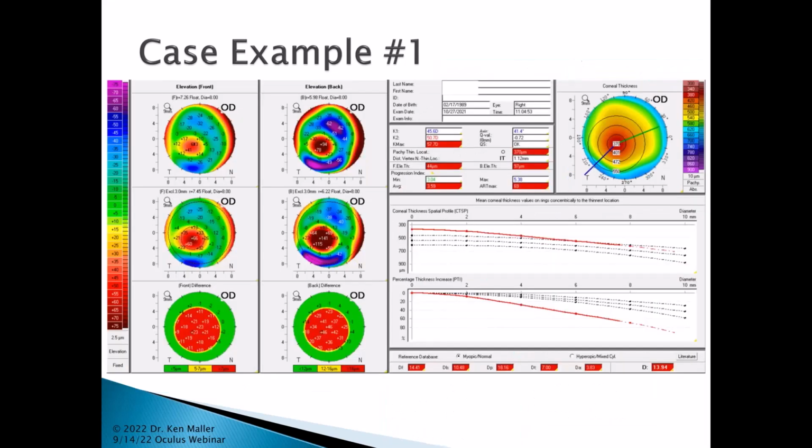So let's move on here to some of the keratoconic analysis software that comes along with the Pentacam. And the first thing we have are the pretty graphical pictures that are on the left. We can see both the elevations of front and back along with the float. And then down at the bottom is a very interesting screen where we can see the front and back differences.